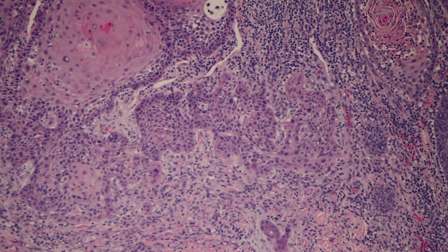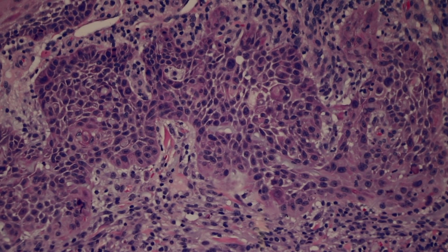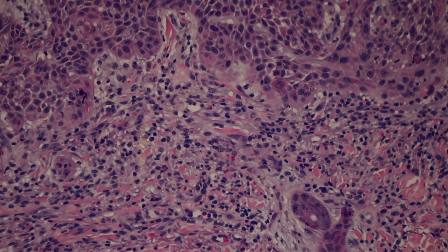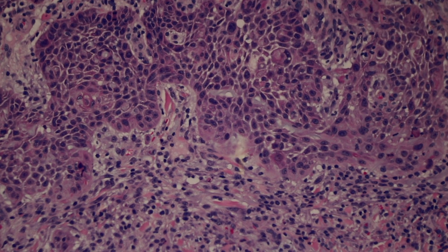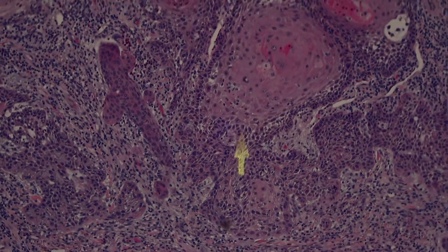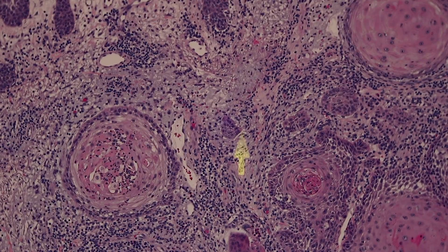So here's the squamous cell carcinoma, the islands of tumor there. And then down below that, there's all this reactive fibrosis and mixed inflammation that's basically the stromal dermal reaction to the invasive tumor. Sometimes it can be helpful to find that reactive stuff to help you know that you're dealing with nests of actual invasion rather than just in situ pushing down a follicle or an adnexal structure.